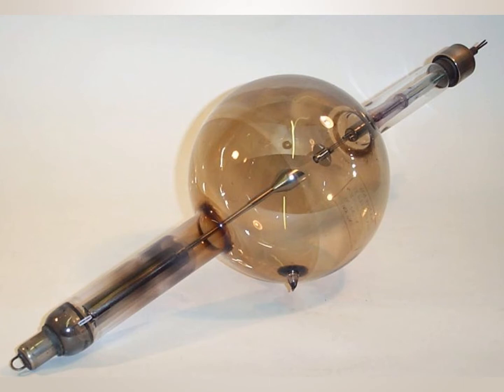Before 1913, gas-filled Crookes tubes were used to produce X-rays. They were temperamental and produced a slow trickle of radiation. Exposure times of 1/2 hour or more were not uncommon.